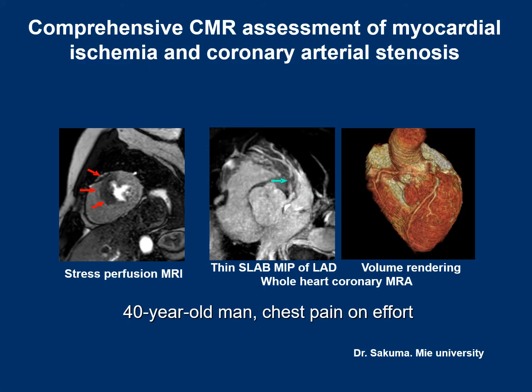The same group also performed comprehensive CMR on patients with suspected CAD. In this example, with chest pain, stress-induced ischemia is observed in the anterior septal wall. Coronary MRA revealed stenosis in the proximal LAD, corresponding to the ischemia in the LAD territory.